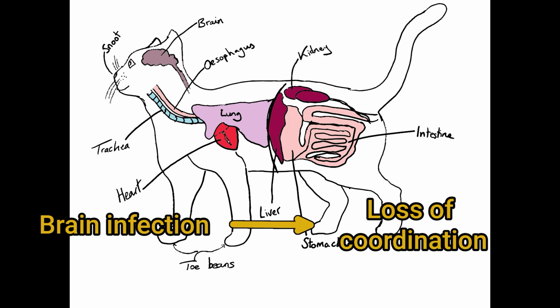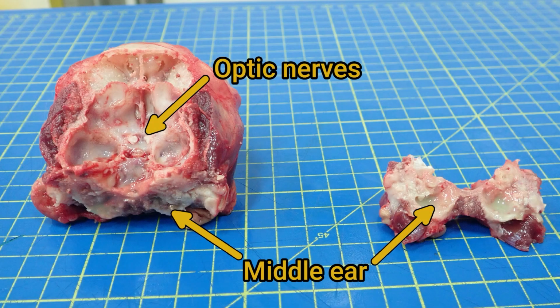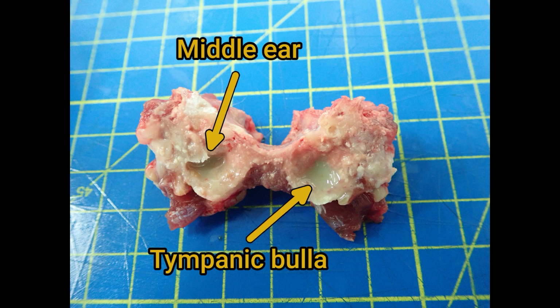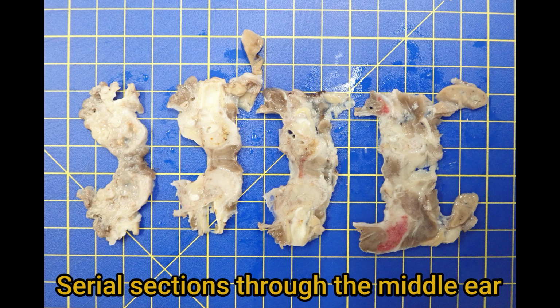It was time to investigate further, so I opened up the skull a bit more to have a look at the middle and inner ear. The middle ear on both sides was filled with material, some of it like pus, but some of it more granular and chalky. We took swabs from the middle ear and from the brain for bacterial culture, and then samples from each of the organs were preserved in formalin and processed for examination under the microscope, a process called histopathology. I preserved the entire head in formalin so I could go back and take sections through the ear canals and associated bony structures.